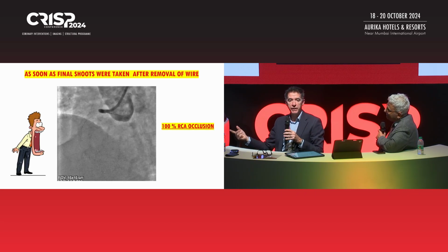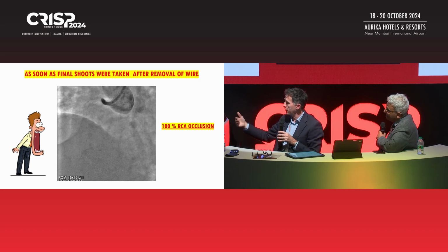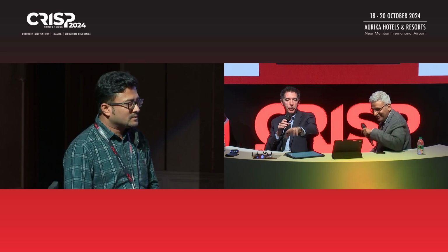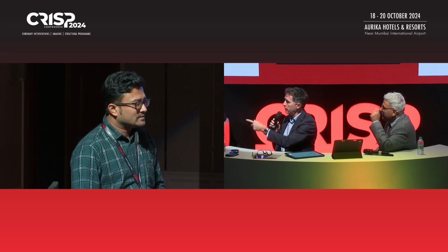So if you play the OCT, which is very interesting, your OCT is starting in the false lumen, and then you're re-entering. So one of the biggest challenges in a case like this is that you should not end up placing a stent in the false lumen. But you're going to stent in the false lumen, because that's where your wire has gone on the OCT. If you play the next OCT, because you've got the stent there, you've got a target. The wire was in the false lumen.